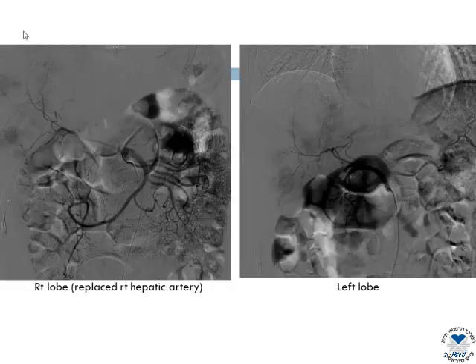But this is a case from our hospital. I have to admit, this is a case with a colorectal metastasis. We haven't employed yttrium in HCC patients yet. I'm not very enthusiastic so far, but just to show you what the technique is all about. You have to do a pre-operative, pre-procedural angiogram in order to prepare the patient for this technique.